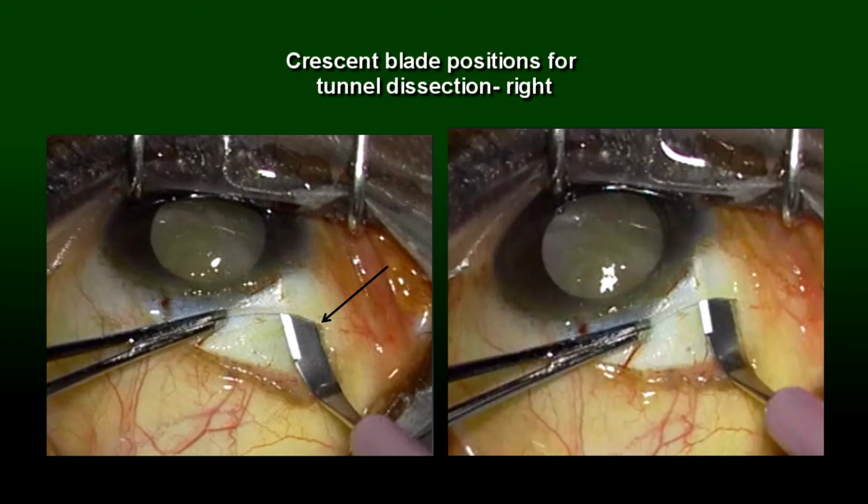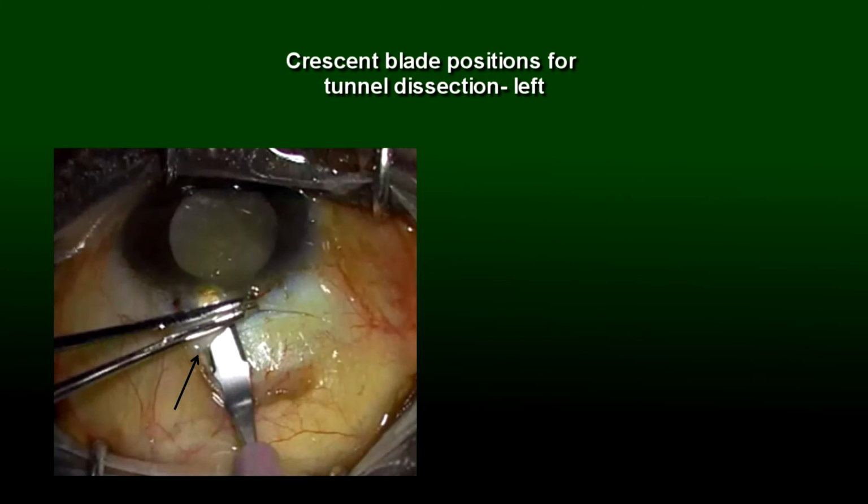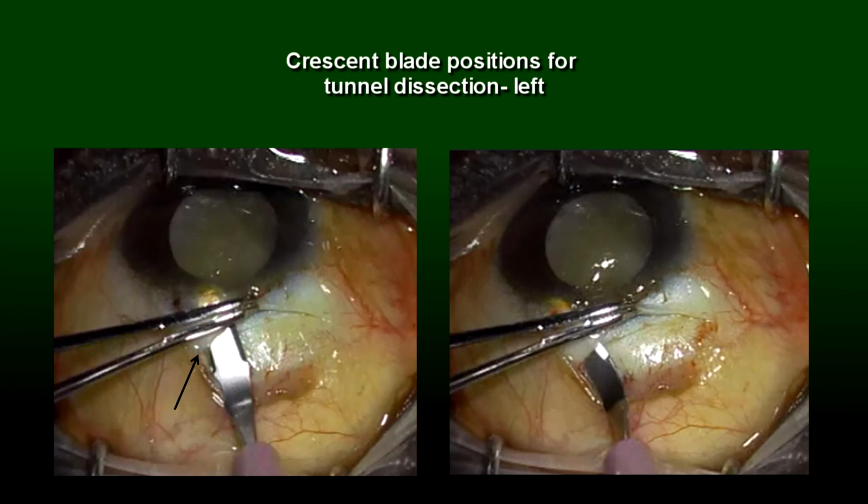Notice that I can just barely see the edge of the crescent blade. It's kind of lined up with the limbus here. That tells you that the angle is about right when you're lined up with the limbus at the side. Any questions about that? On the left side, use the other corner of the scleral groove. You can see it now, it's still pointed, so I've got this uncut corner right here. And I'll finish that, turning it out.